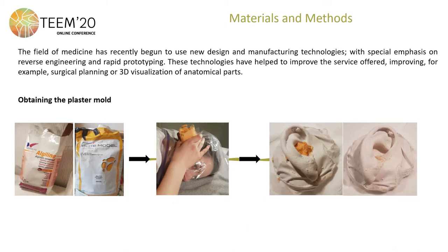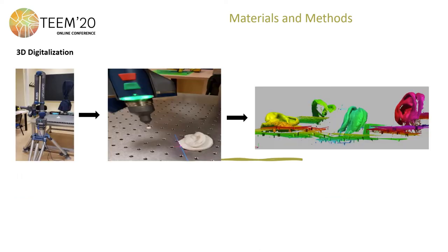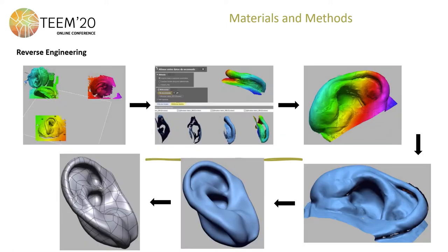To begin with the realization of the prosthesis, first the model of the patient's healthy ear must be obtained. Afterwards, we proceed with 3D digitalization, where the physical mold is transformed into a virtual mold. Then comes post-processing, where possible defects of the 3D scans are corrected.